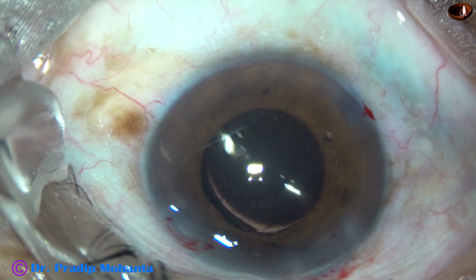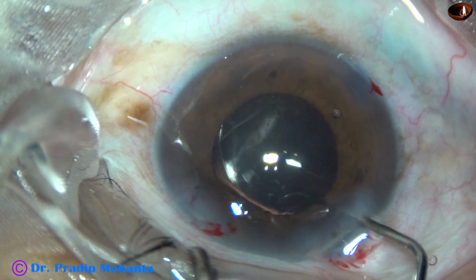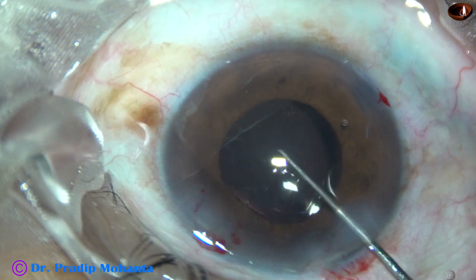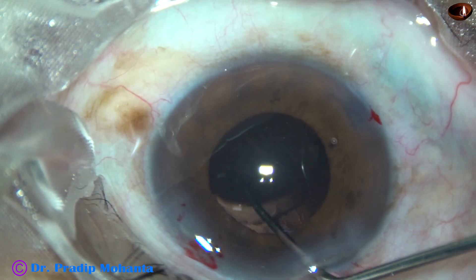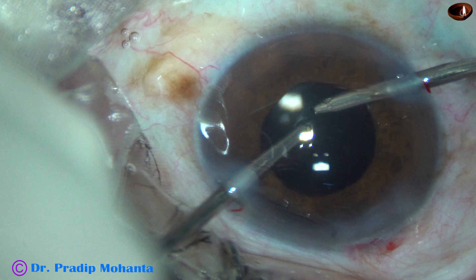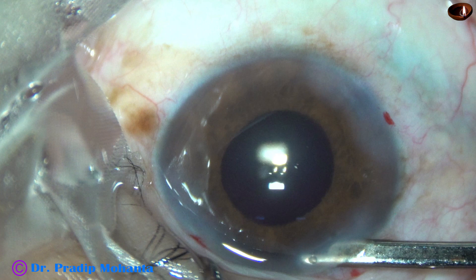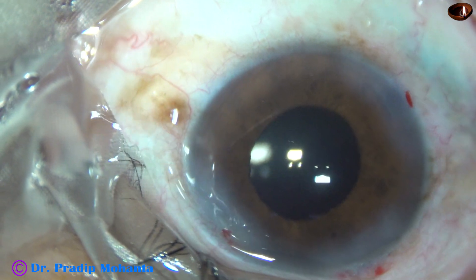The intraocular lens is dialed to place the haptics about 90 degrees away from the main wound so that we can clean the visco from behind the IOL. Visco cleaning is done nicely. The anterior chamber is formed very well, and then the integrity of the wounds is checked.